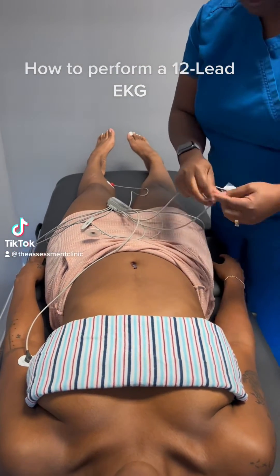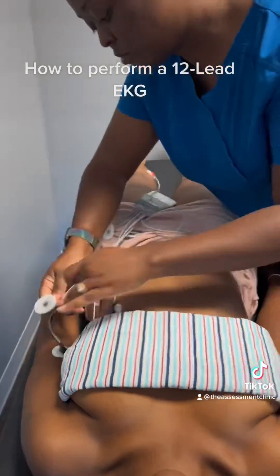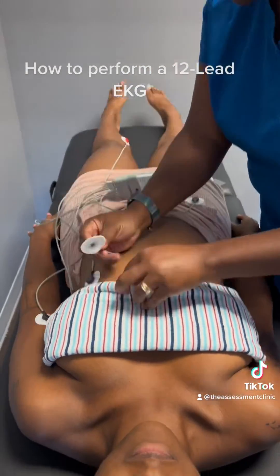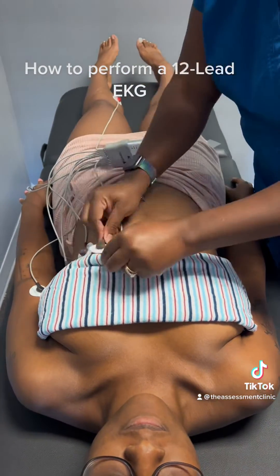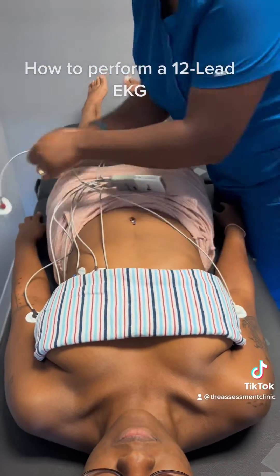Hi guys, today we are performing a 12-lead EKG on a female and a male. Although it is called a 12-lead, there are only 10 leads — one lead for each arm and one lead for each leg.